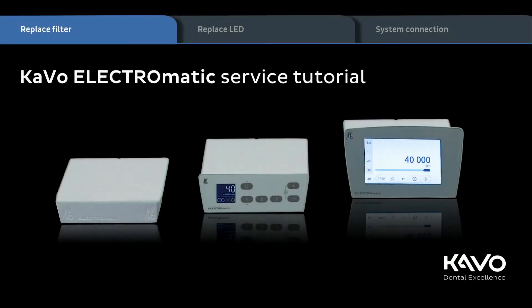In this video you will see the Electromatic service tutorial. First of all, look how easy it is to replace a filter.